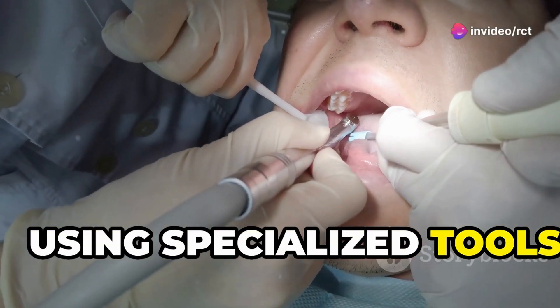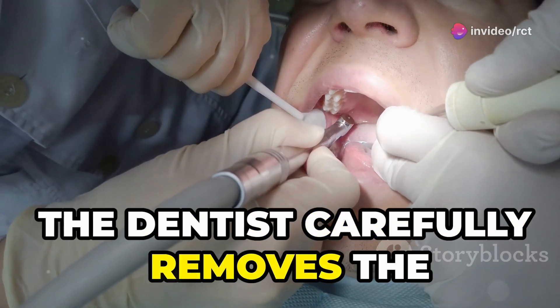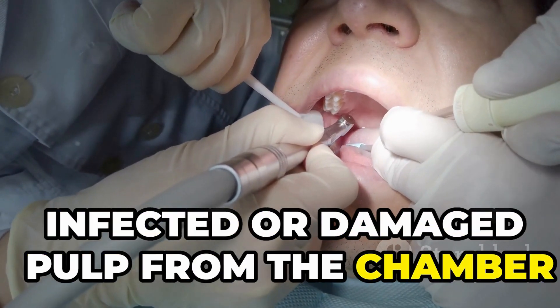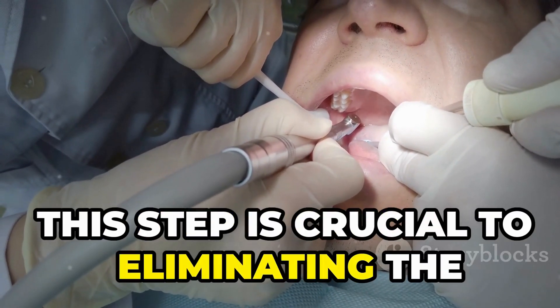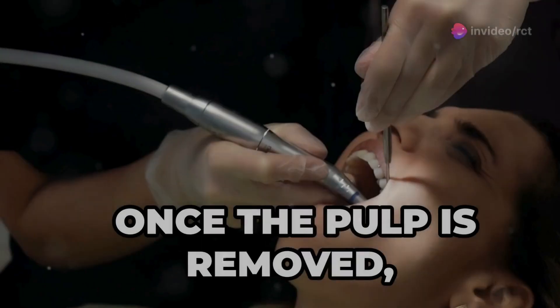Using specialized tools, the dentist carefully removes the infected or damaged pulp from the chamber and canals. This step is crucial to eliminating the source of infection and relieving pain.